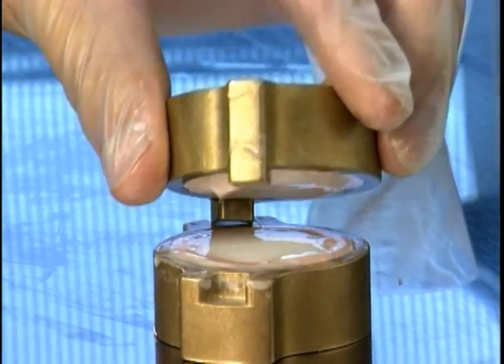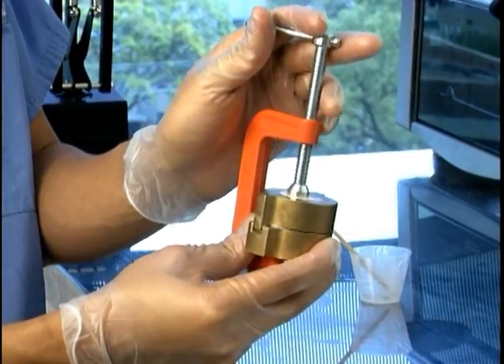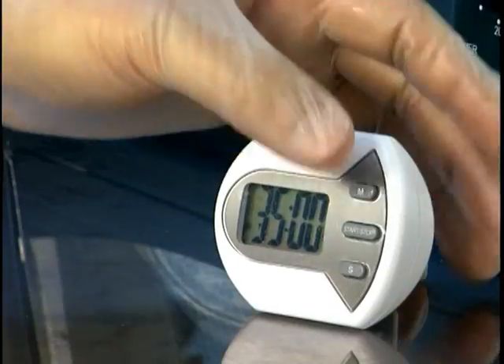Apply scleral silicone to the posterior mold and place onto the anterior side. Clamp the mold and wait for two minutes, allowing air bubbles to clear. Finally, place the clamped mold into a preheated 200-degree oven for 35 minutes.